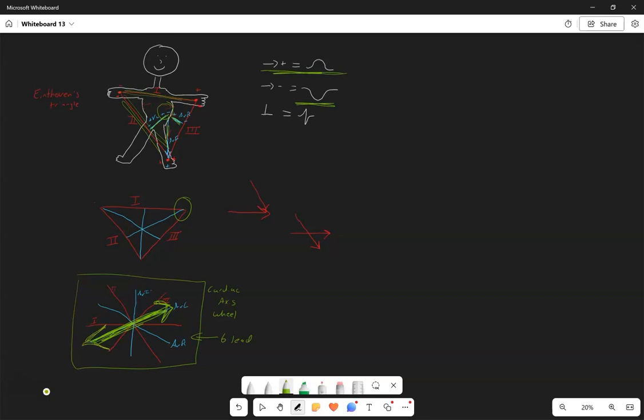Okay, so what we can do is we can look at the EKG or the ECG, and we can look to see how the signal, the electrical current, is running throughout the heart, and that is an awesome diagnostic tool for us understanding the electrical conductivity of the heart, what's going on in the heart, and whether things are operating normally.